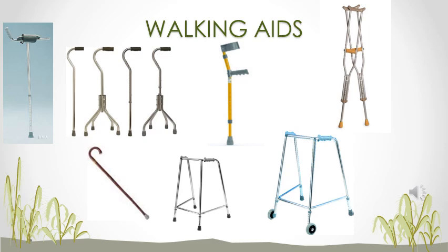As a revision, the various different walking aids, or as we call them, mobility aids as well. Here you can see on your top left you have a gutter crutch.